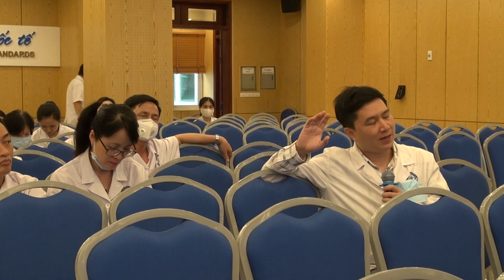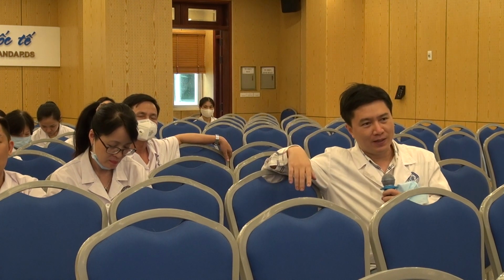So that's why so far accommodative IOL is not commercially available in the market. As far as I know, for presbyopia correction we have many other options, like multifocal or EDOF, a new concept of enhanced depth of focus IOL, like Synergy, or now with Vivity available.